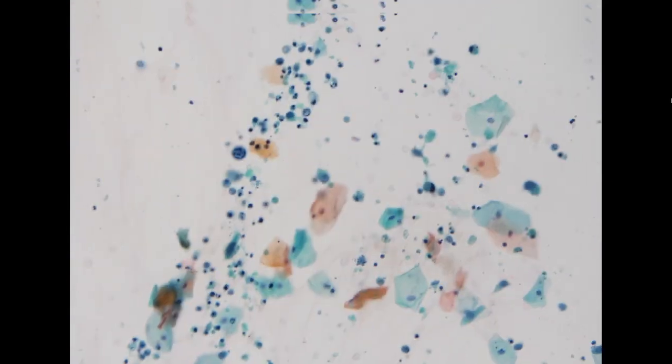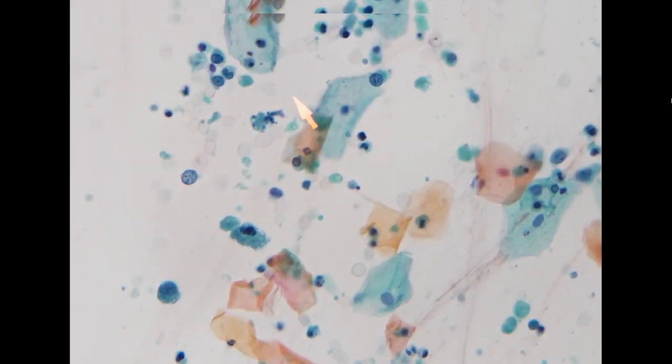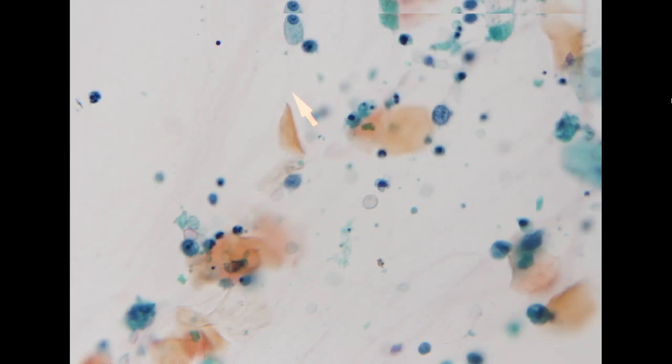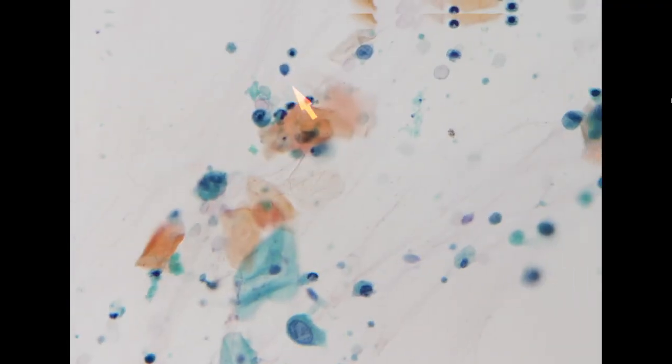So for the voided urine specimen, it is important for us to identify these degenerated but still hyperchromatic cells, and we call these atypical. For the prior case that is caused by the stone atypia, we call it negative.